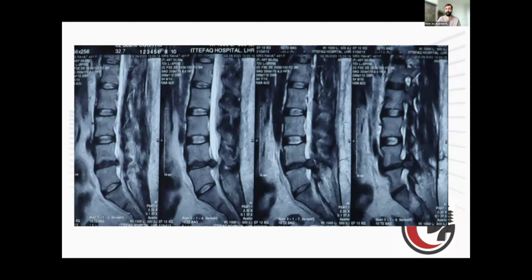Rizwan, is there anybody on the line that's using endoscopy during their fusion procedures? Yes, I go into the disc space with the camera, and a few times we use a shaver even to remove all the fragments and wash that area and to see the end plates bleeding.